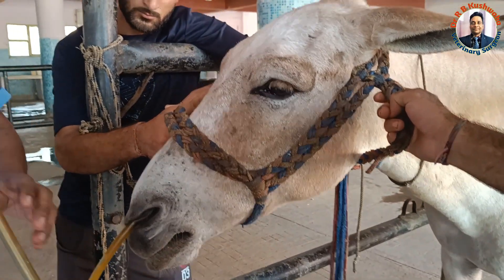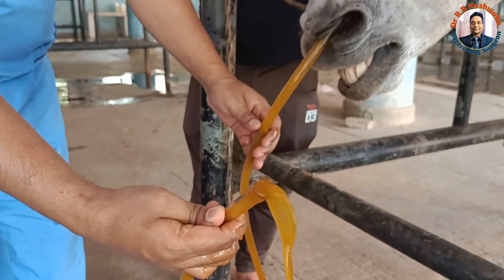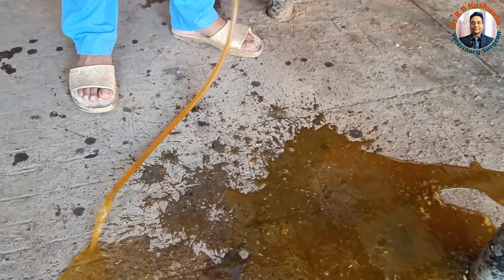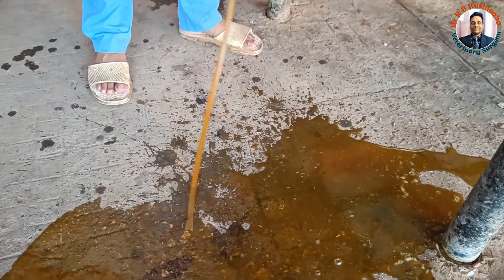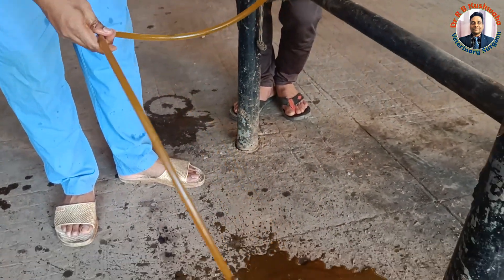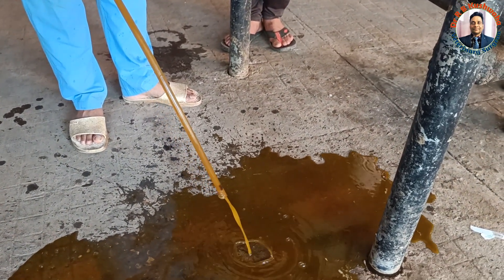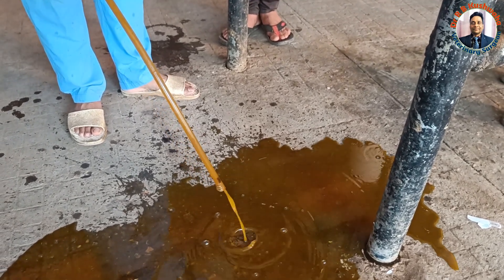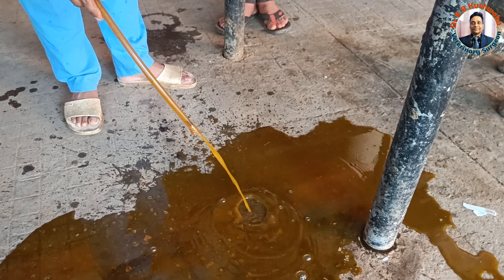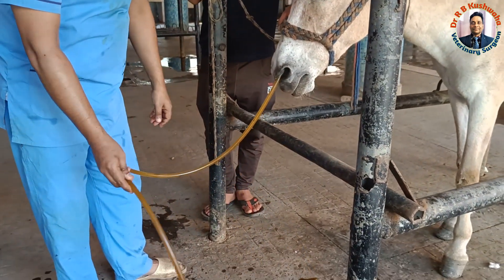If it is not progressing and you feel some resistance, you can assess from the tube position. You can see how much distance it has traveled — just by passing, fluid is coming from the stomach. This is the gastric content, and here the content is more than 2 liters.